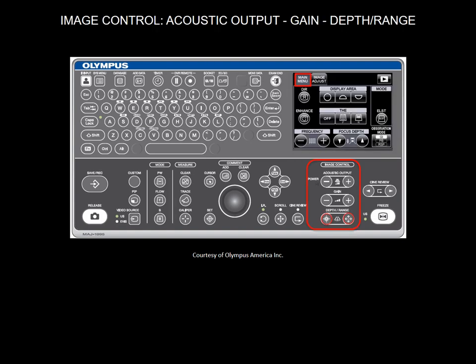Acoustic power is usually left to maximum. The gain is one of the most used scanning parameters. Increasing the gain makes the image appear brighter.